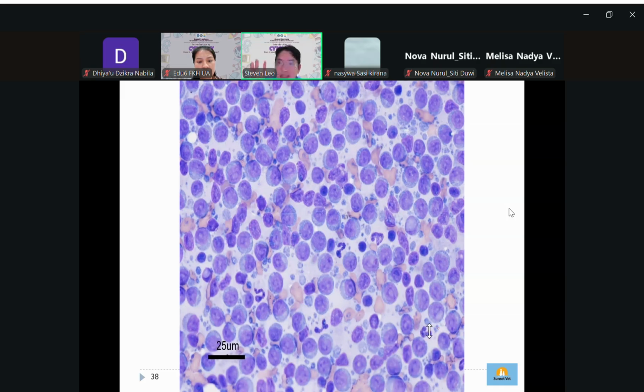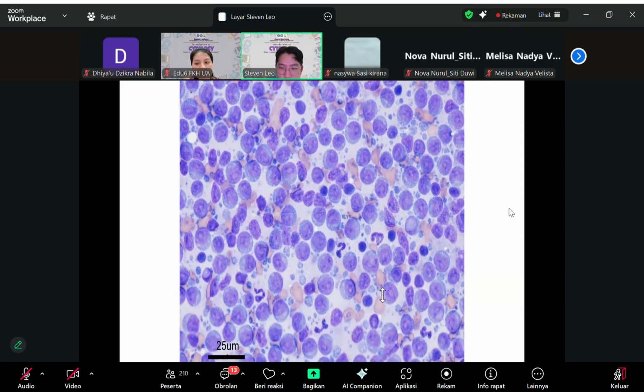But in your opinion, is it more white blood cells or more of another cell that you don't know? Yes, it's typically the other cells that you don't know. Okay, so this must not be inflammation.